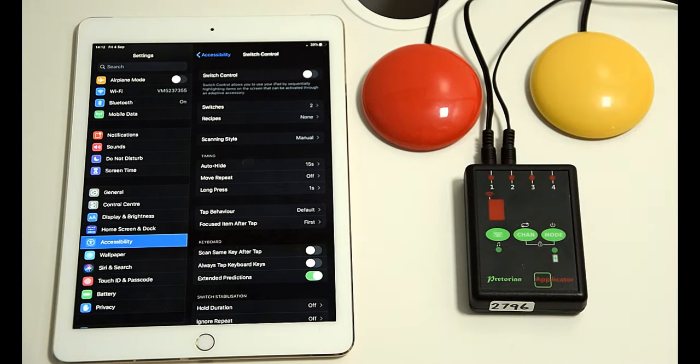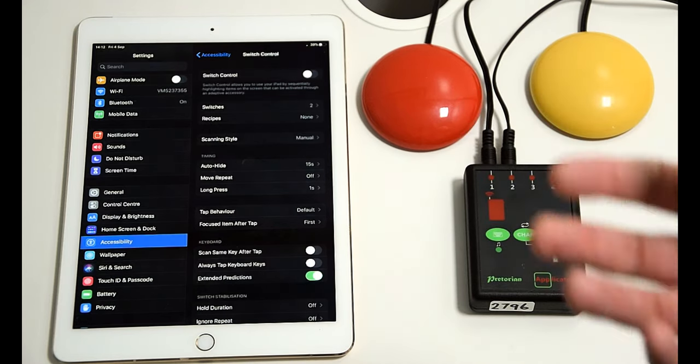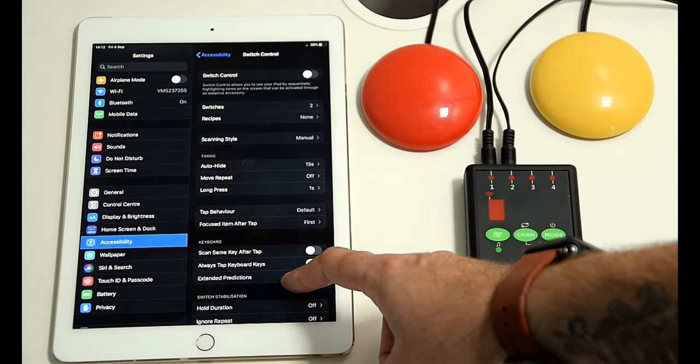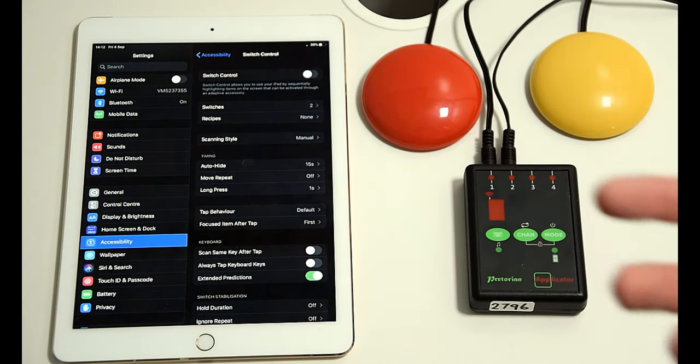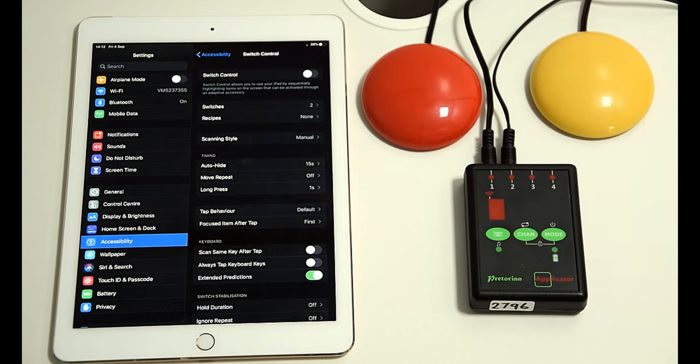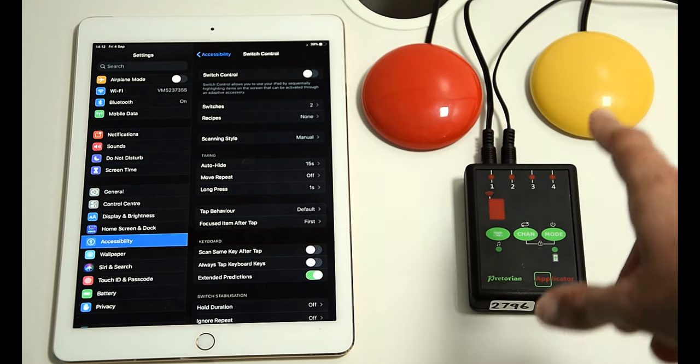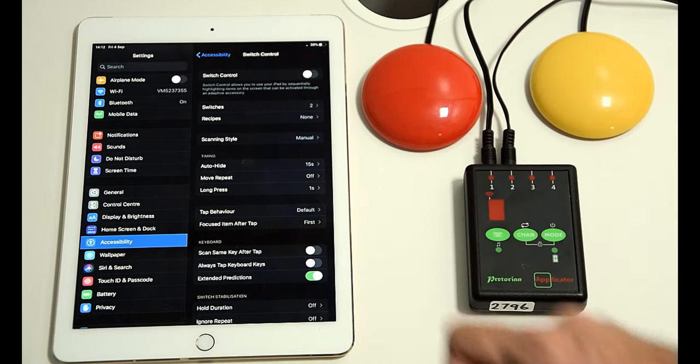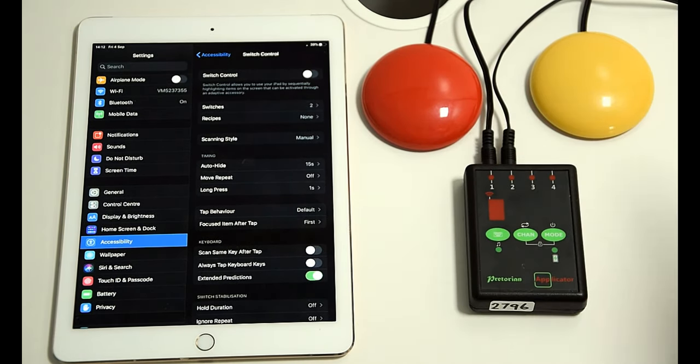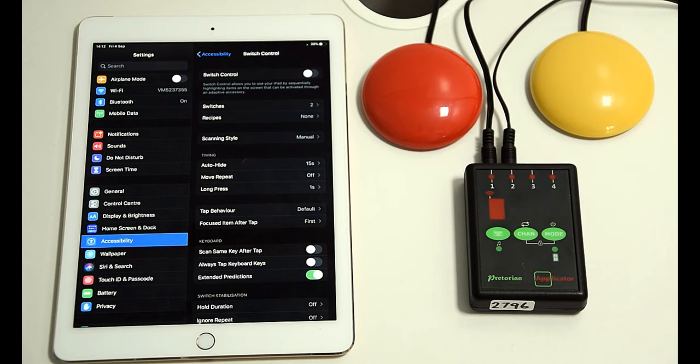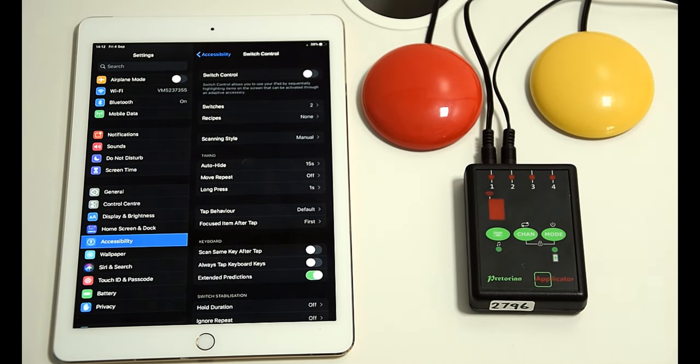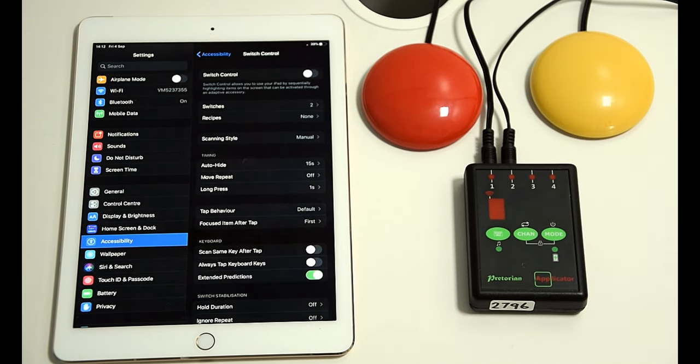So those two could be their normal sort of device action, so scanning across the different items and selecting. Then you could have two more plugged in specifically for that recipe of turning the pages backwards and forwards.